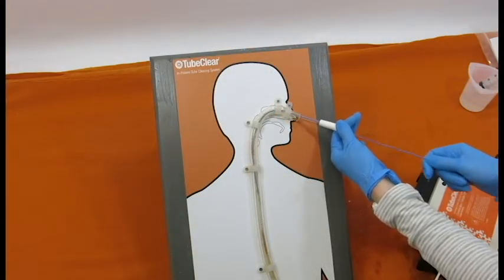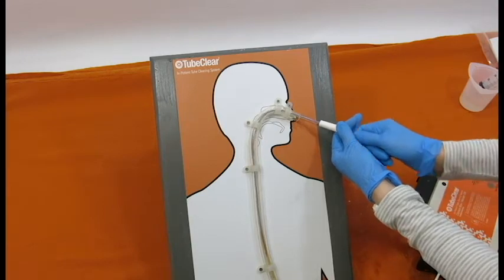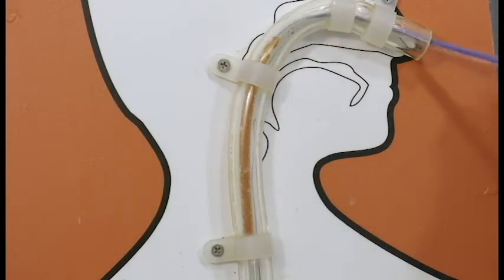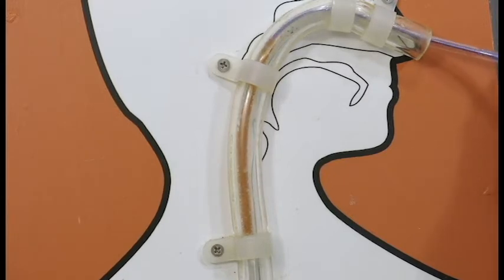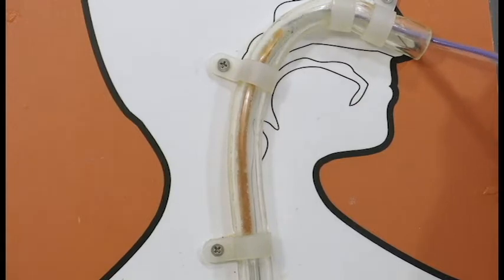These clogs require long, smooth strokes with lots of water. Short, quick strokes are not as effective against sticky clogs. The most effective technique with sticky clogs is to spread out the material as much as possible.